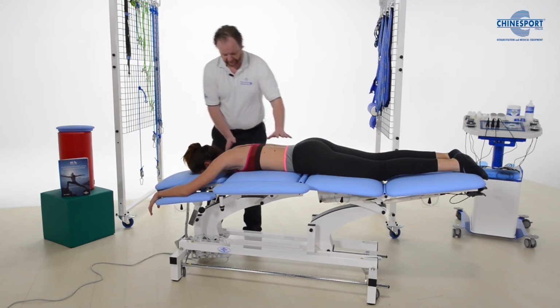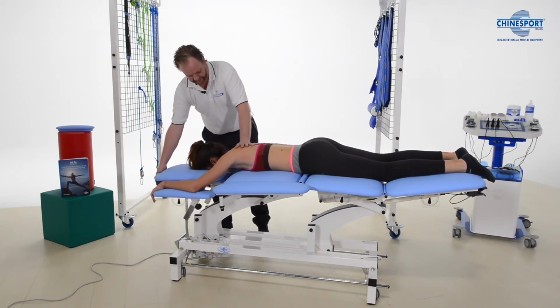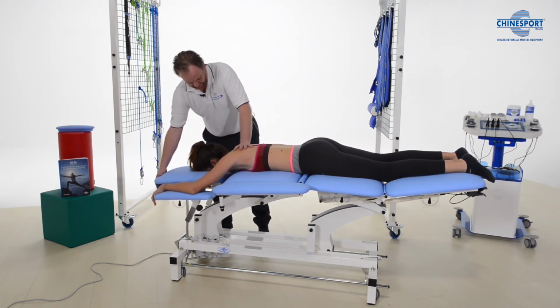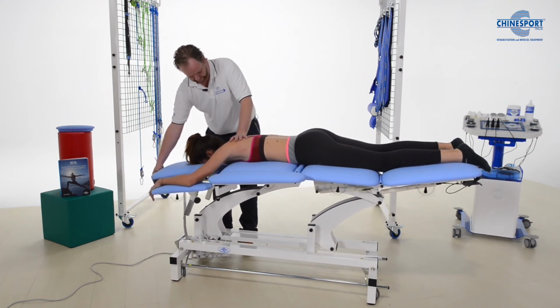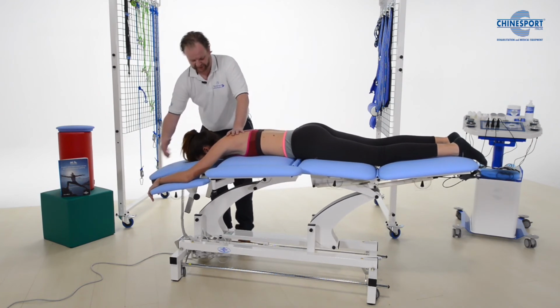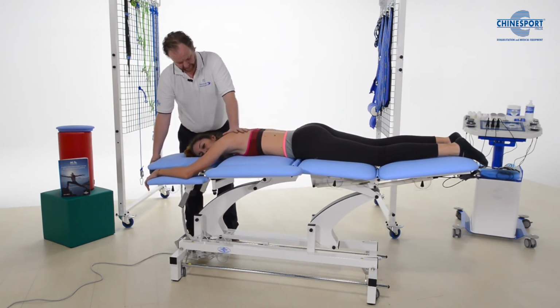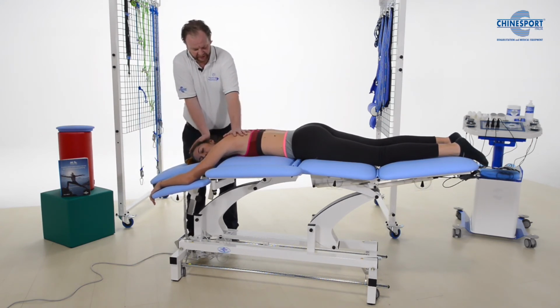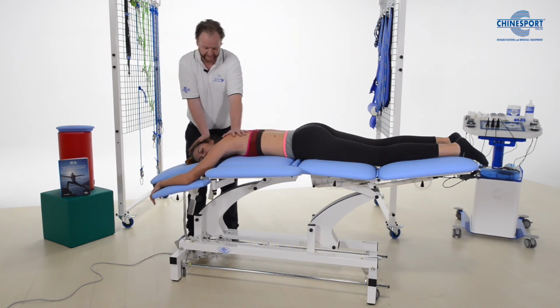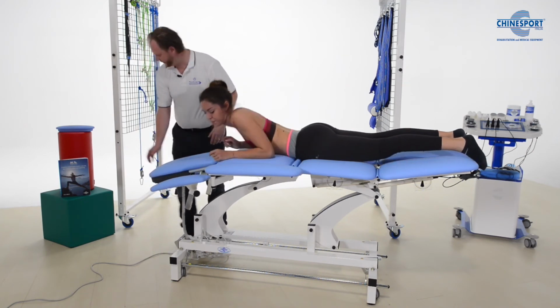We can also, if she moves down a little bit more, go into neck mobilizations. We can add some rotation. If she just looks towards one side, we can add some rotations. And we can add some stretching as well for the cervical musculature. There we go. Okay, you can turn around now.